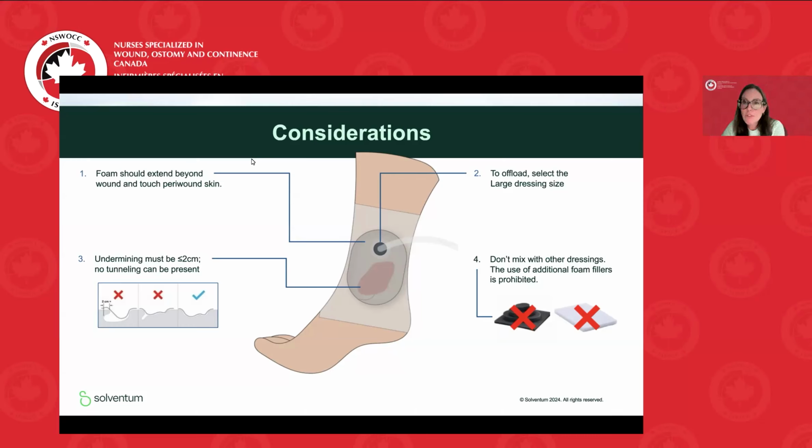Doesn't happen very often for me, but if I have a wound that is larger in size than it is in depth, you size up. You want to make sure that you accommodate the depth, but if your wound is larger than it is deep, you want to make sure that you're still overlapping. So you can size up to accommodate that. In the States, I haven't yet had any issue with insurance when I'm trying to treat a smaller depth wound with a larger dressing. Again, this is somewhat new, but so far that has not been an issue at all.